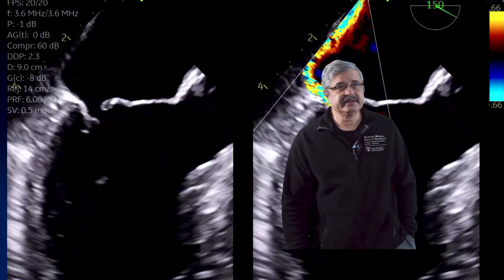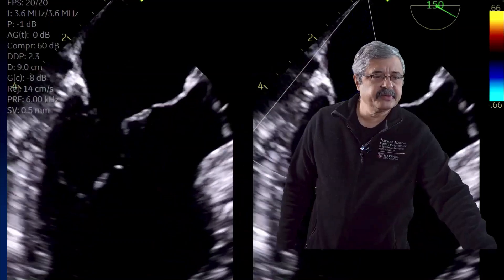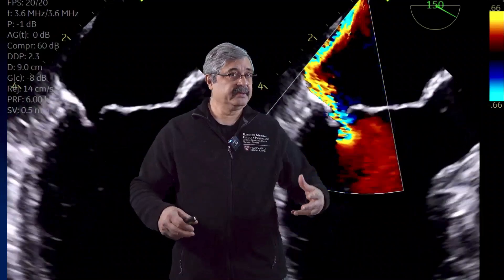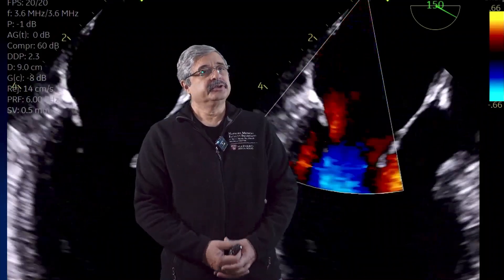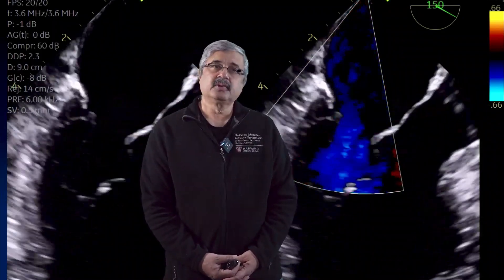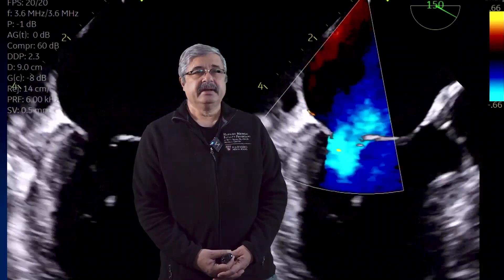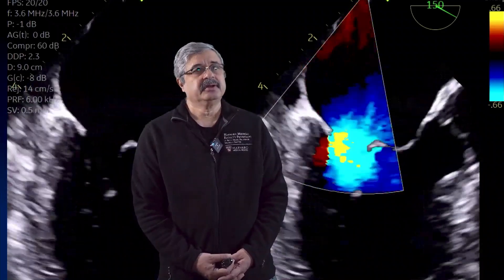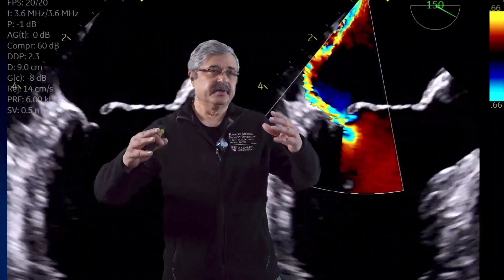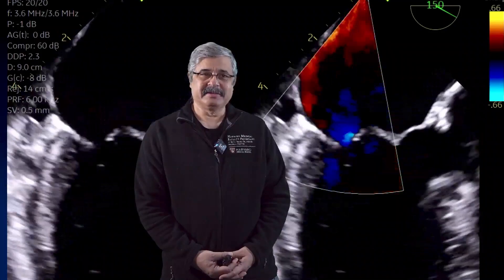In final summary, vena contracta should be measured in the mid-esophageal long axis view. Use the least amount of depth for the largest image. Adjust the color flow Doppler Nyquist limit, move the baseline towards the direction of flow, and use zoom mode. Demonstrate the narrowest portion of the jet along with flow convergence, contraction, and expansion to make a measurement that minimizes all the limitations discussed. I hope you learned something from this How I Do It series. Thank you.